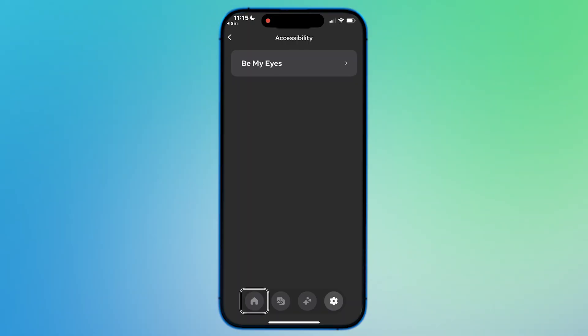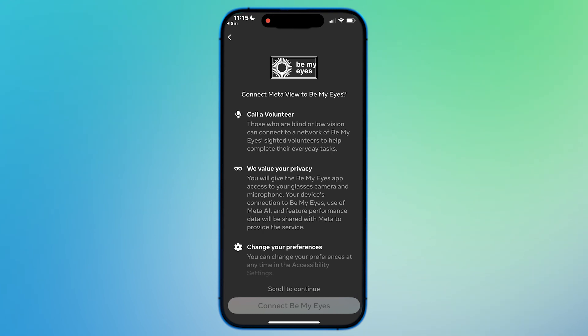Now if you're watching this later on, you might see Aira in here at that point. But right now we just have Be My Eyes. So we're going to tap on that. On the Be My Eyes screen, we should be able to find an option that's going to allow us to enable or turn it on.